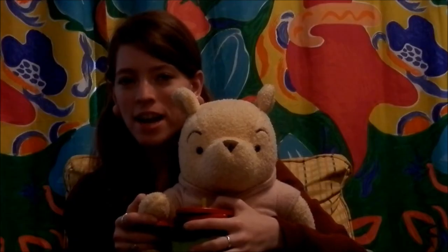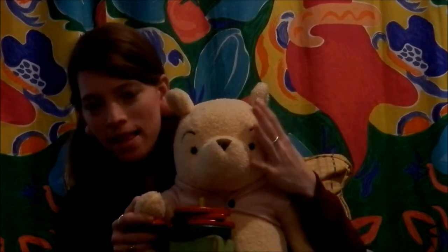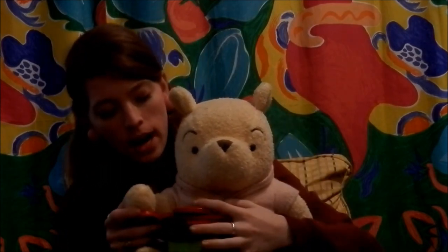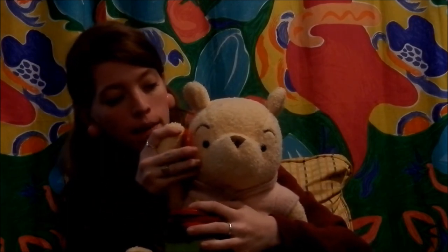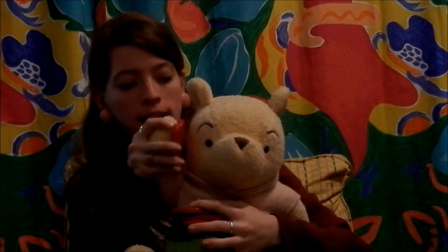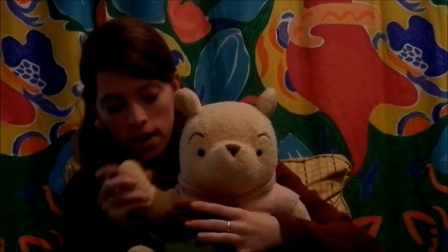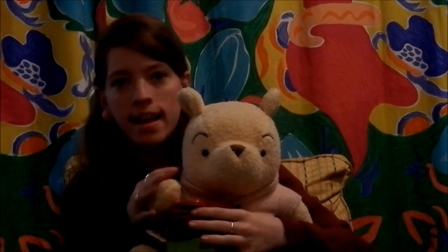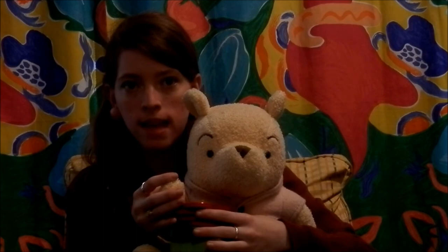This is what the hand-over-hand strategy for Play Audiometry would look like. Here is my little child Poo. I would help Poo hold the toy next to his cheek, and when I present the sound "Poo," I would help guide his hand to stack the toy onto the tower. I would repeat it again and continue to do this technique until he was able to do it by himself. The hand-over-hand may be phased out as your child begins to learn the expectations of Play Audiometry.